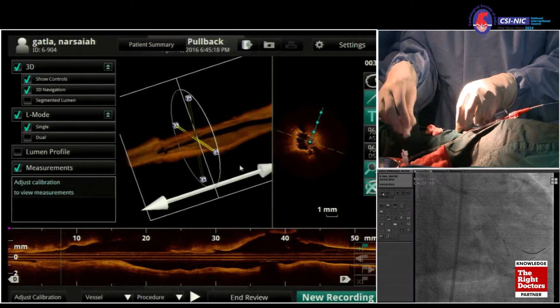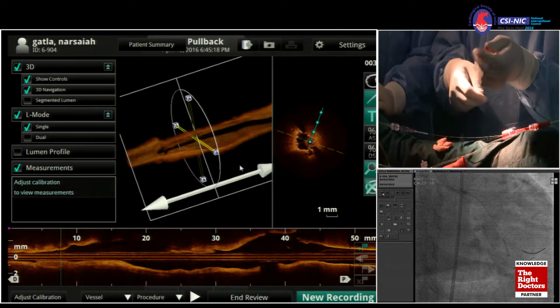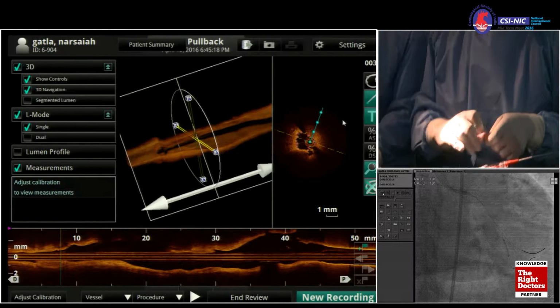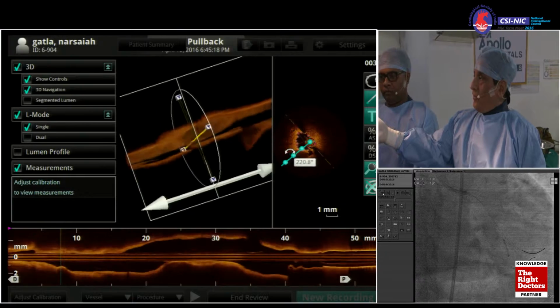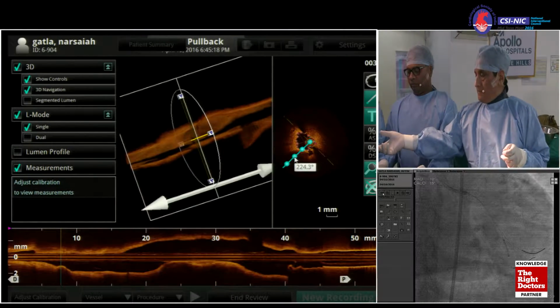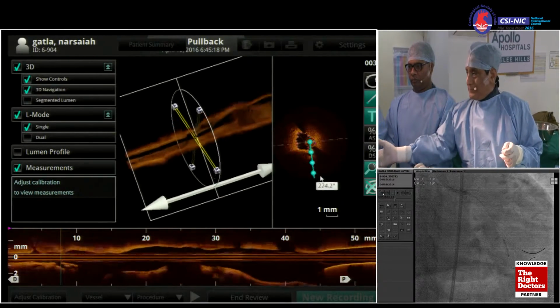My point was that you have no doubt demonstrated that the side branch is diseased. Do you think to decide between a 2-stent or 1-stent approach, we need FFR in the branch? Well, that could be one, but remember in this case, there is a lesion before. So your FFR will not answer, because you will have a positive FFR even in the superior branch. You dilate the lesion proximally, and then do you actually need the stent in that branch or not?